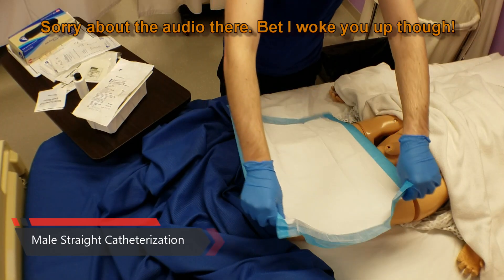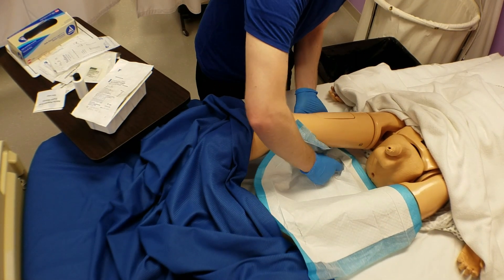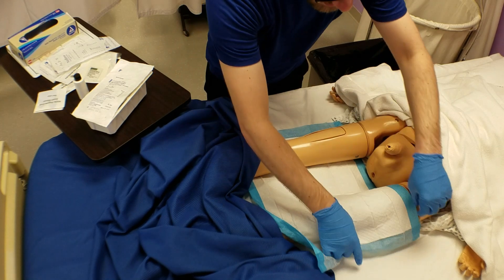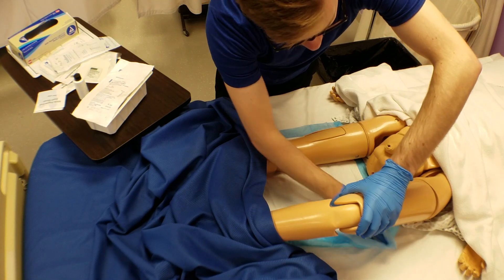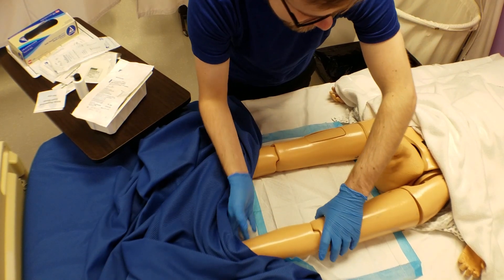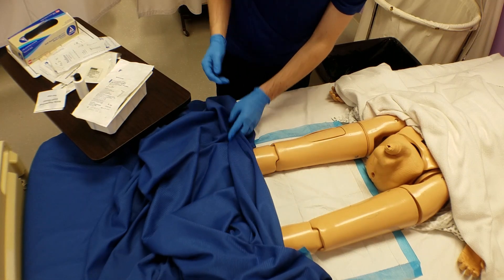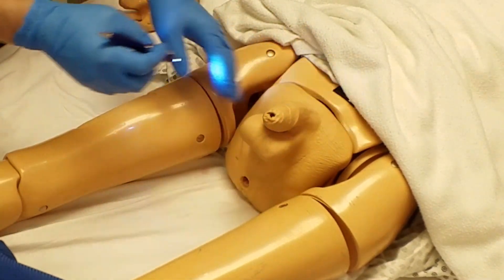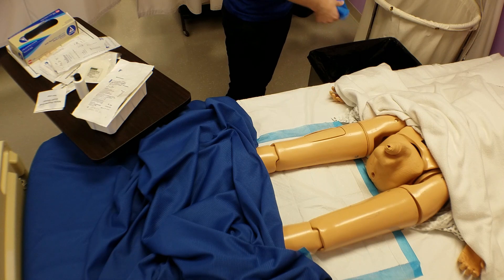When your evaluator tells you the mannequin is ready, begin by putting your male patient into the correct position for perineal assessment and catheter insertion. Male patients should lay in a supine position with the legs slightly separated. Place the chucks underneath the patient while ensuring that the patient's privacy and warmth is retained. You can cover the upper body and most of the lower legs fairly easily for male patients. Adjust your lighting as needed for good visualization of the penis. Inspect the perineum and penis for erythema, drainage, and odor. Perform peri-care as needed with soap and water, and determine if you would need additional assistance. Verbalize your rationale to your evaluator.